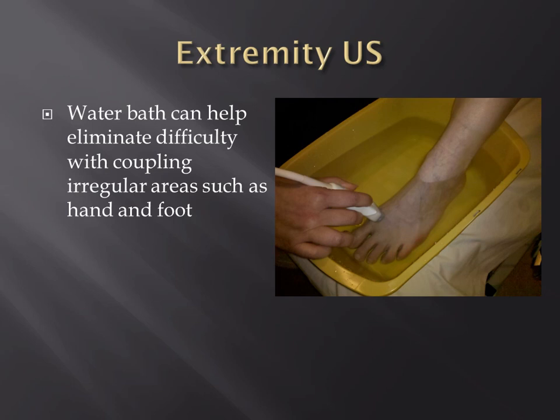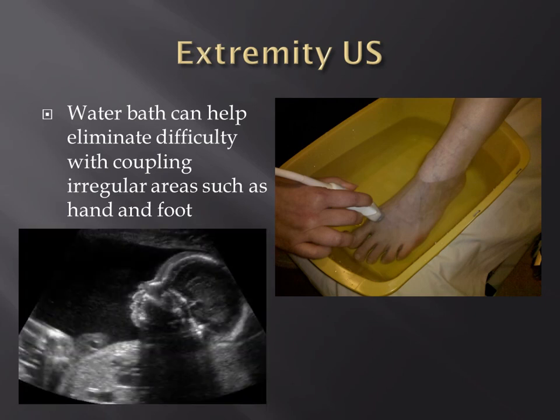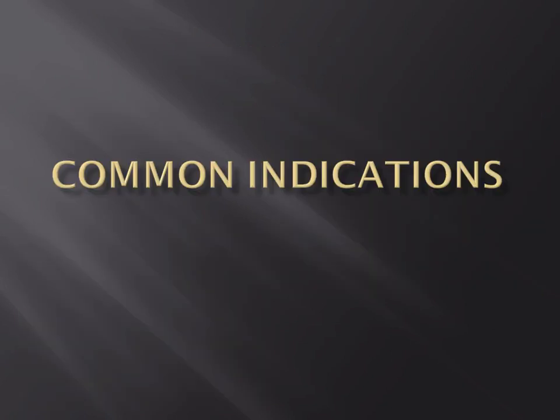You put them in this water bath, you don't have to touch their foot. You can leave the transducer 1 or 2 inches off the skin surface. And you can look, and it's just like they just put it underwater, and that's all that they know. And of course, you do this daily when you're looking at OB ultrasound. This is like the anatomic water bath with the amniotic fluid providing that acoustic window. So we found this pretty helpful, and we use this a lot. You'll see some of the images that I'll share with you today are from using this water bath technique.